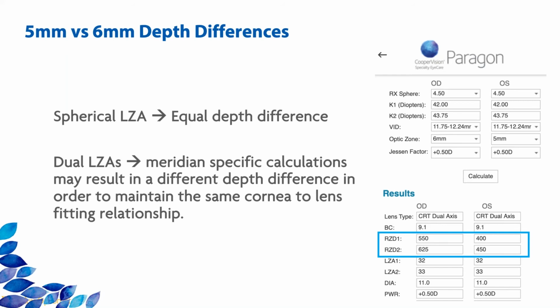Correct. So for some eyes, even though I'm not blinded from the study, by the way, all of the subjects are semi-blinded from the study design. Most of them are optometry students. And if they care to look with their slit lamp, they will notice the drastic difference in terms of the RZDs. And if they really want to unblind themselves in understanding which eye is wearing a test lens versus control lens, they can pretty much tell by the laser markings on the lens.